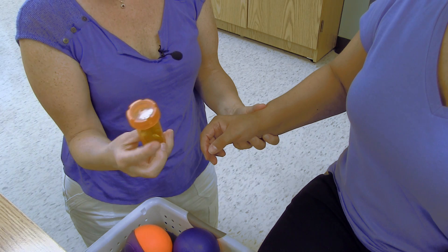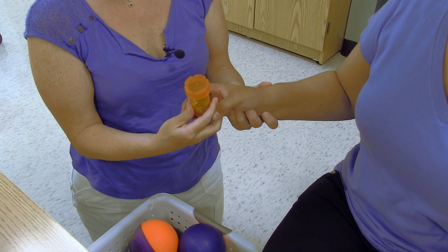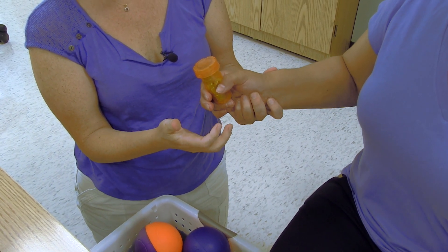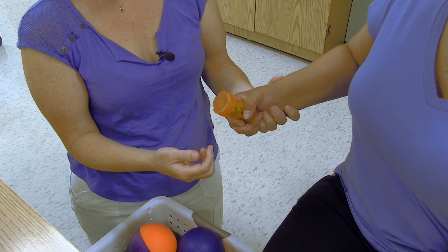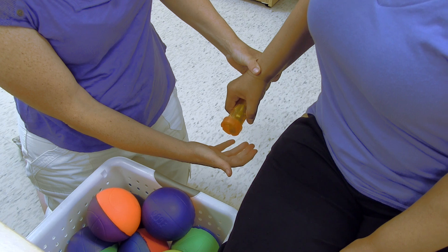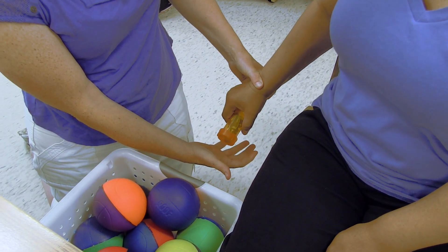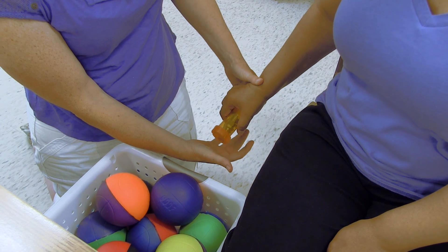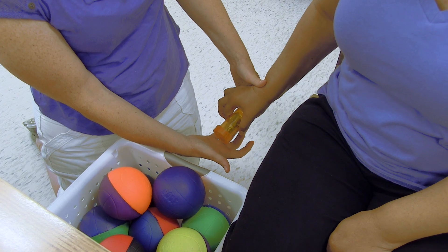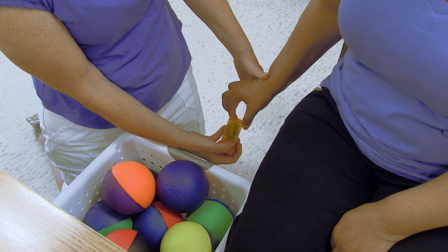So now we're going to use a medicine bottle which is smaller, because she has flexion to grasp it. It has weights in it so that when she brings it down, the weight is going to help her release it — open it. The bottle is smaller so it will hopefully help her with the release, because she has too much flexor tone kicking in to release, and the bottle is smaller with the weight.